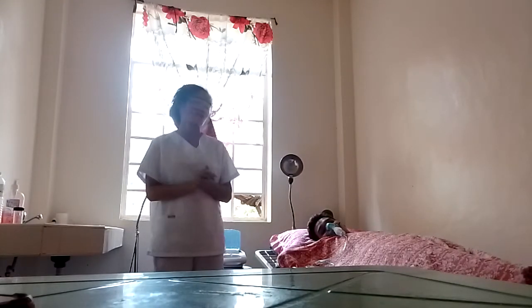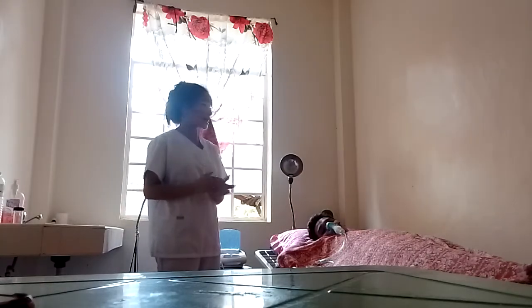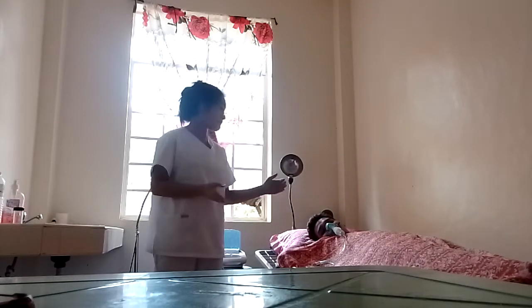Okay, and then after that one, dili sa nato i-remove ang iyang face mask since naglisod og breath ang ato ang pasyente. And that would be all for today. Again, I am Giselle Bolfatuting, and that would be all about oxygen therapy. Thank you.